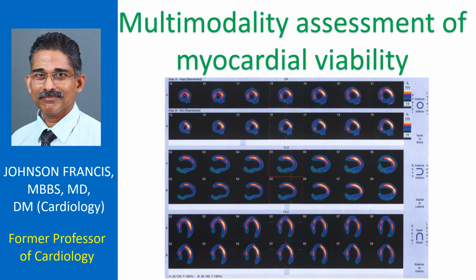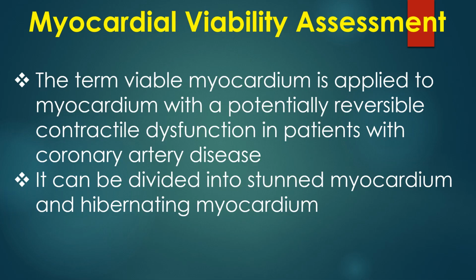Discussion on multimodality imaging for assessment of myocardial viability. Myocardial viability assessment is important prior to decision on revascularization. The term viable myocardium is applied to myocardium with a potentially reversible contractile dysfunction in patients with coronary artery disease. It can be divided into stunned myocardium and hibernating myocardium.